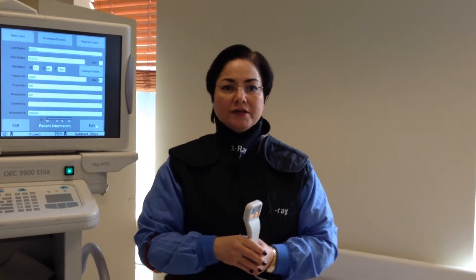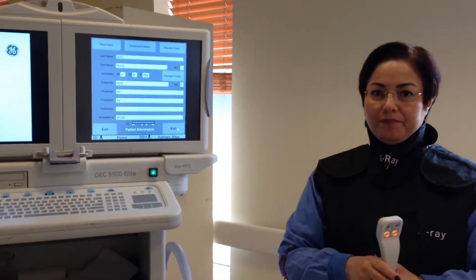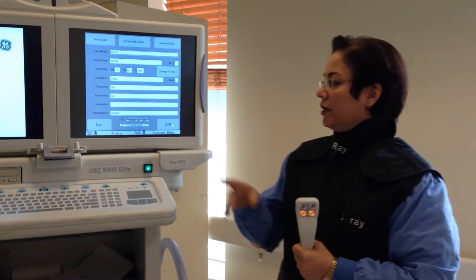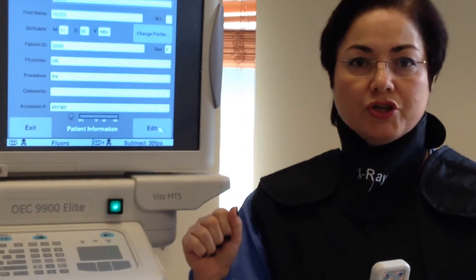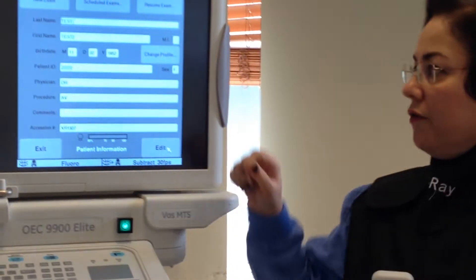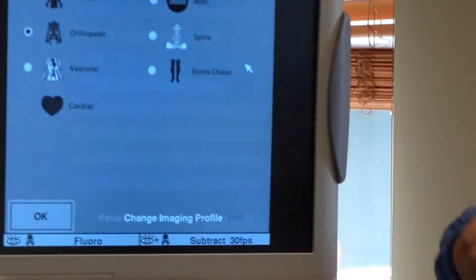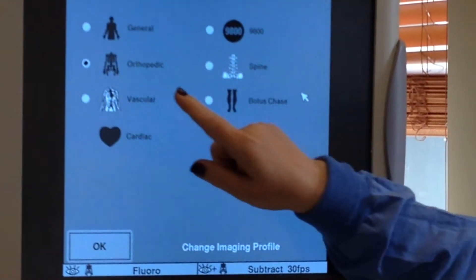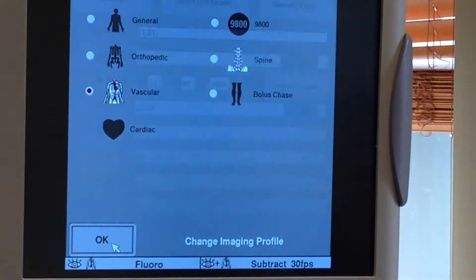First we start with subtraction. On the patient information page, we have to change the profile to vascular and then press OK.